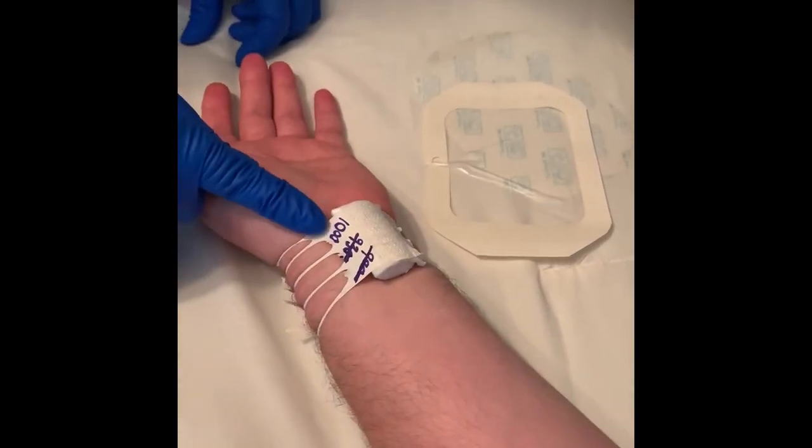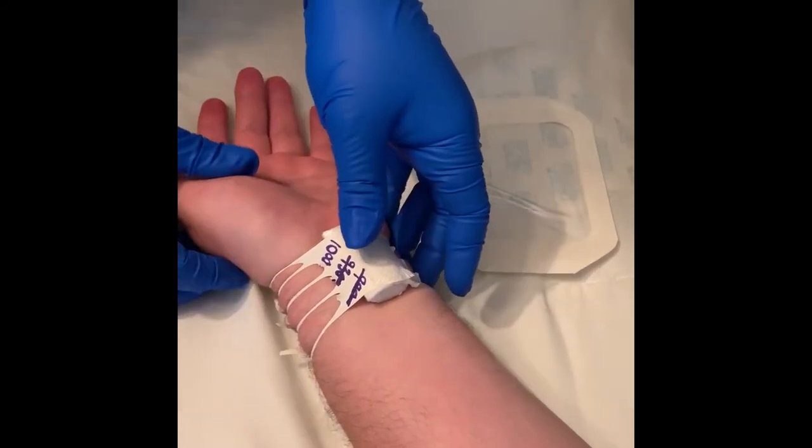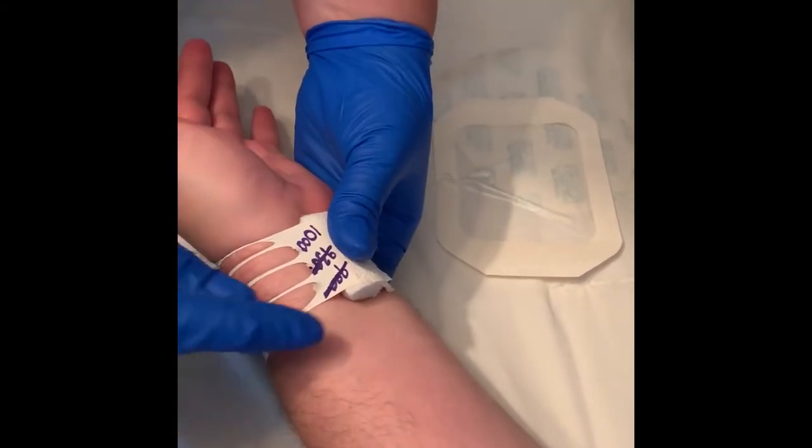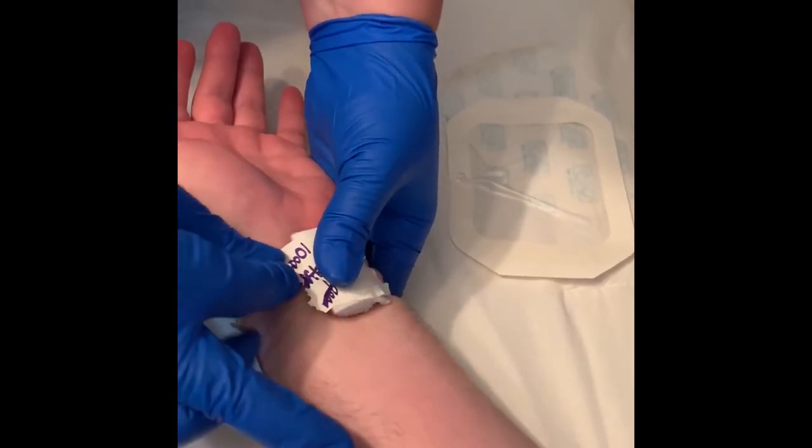Cross off time number two. At the one-hour mark designated by time number three on the band, place your thumb over the center of the bandage while releasing all of the bands on one side of the dressing.